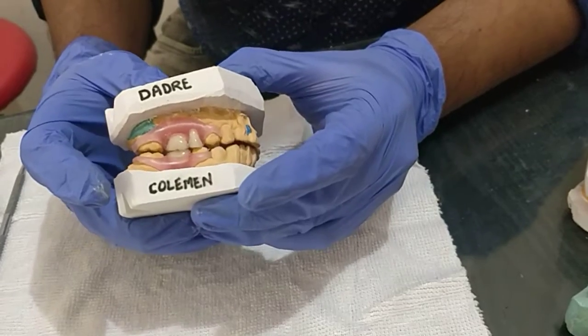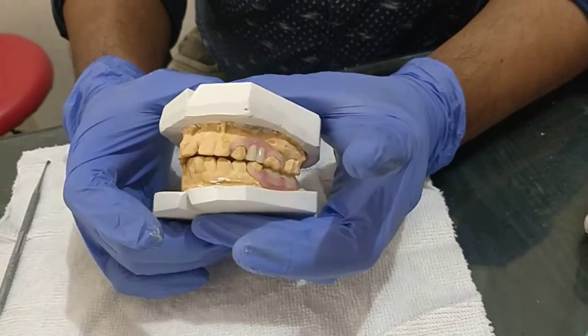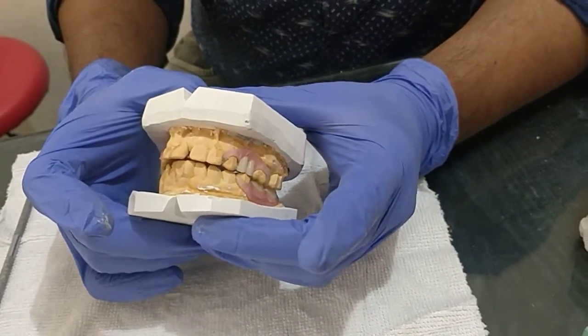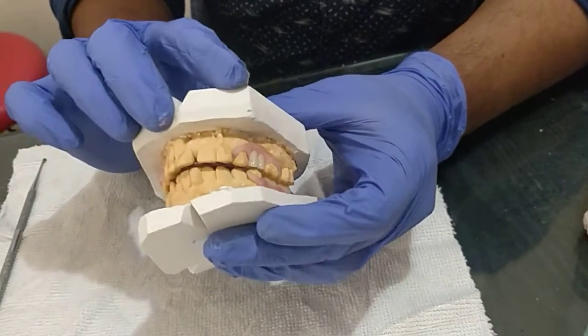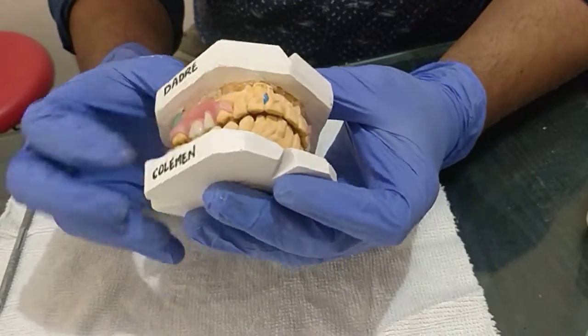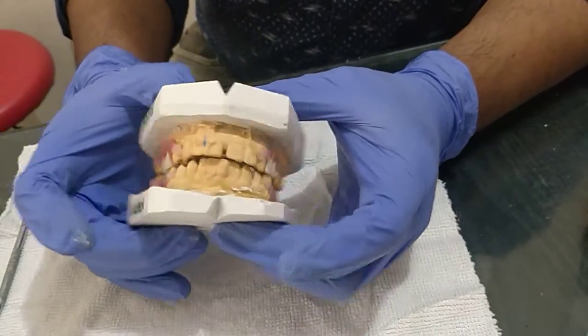So this is the occlusion — from the anterior and from the posterior, you can check the occlusion. They are now able to bite and chew with the molars.